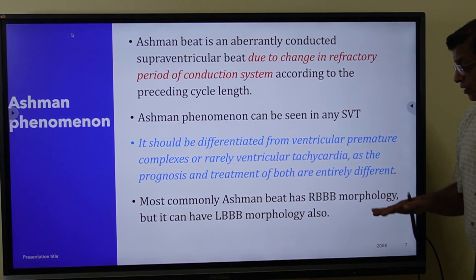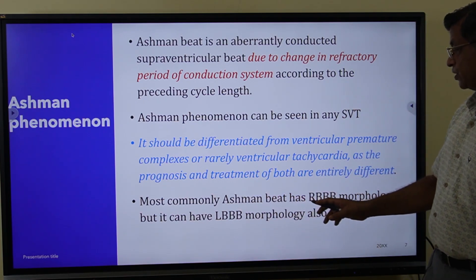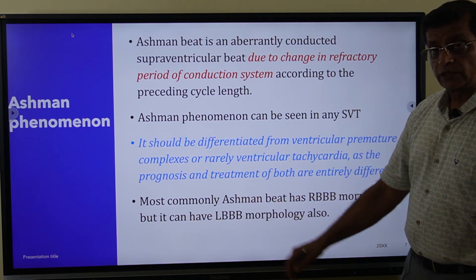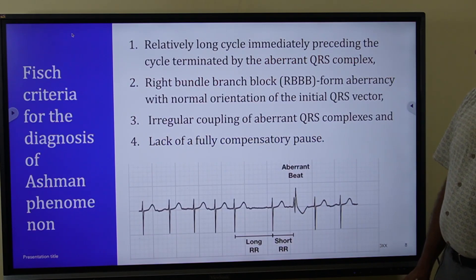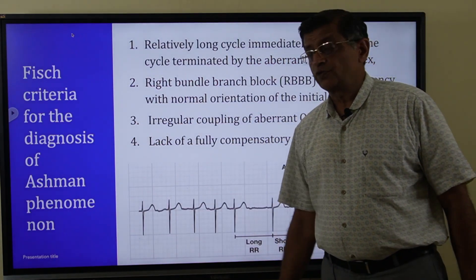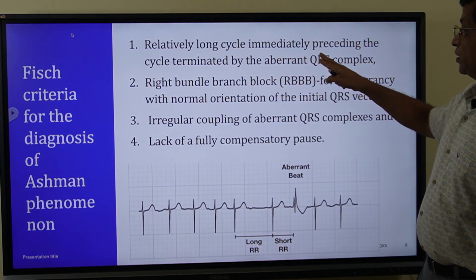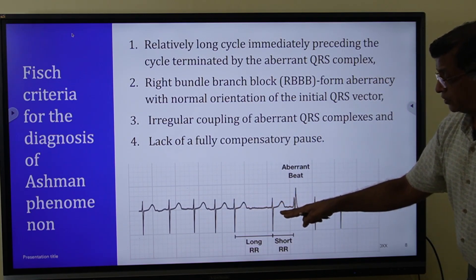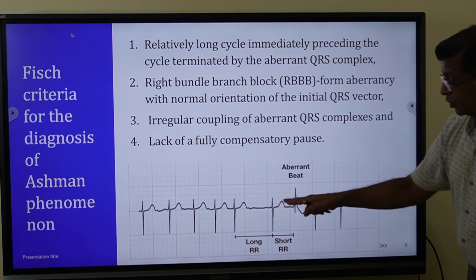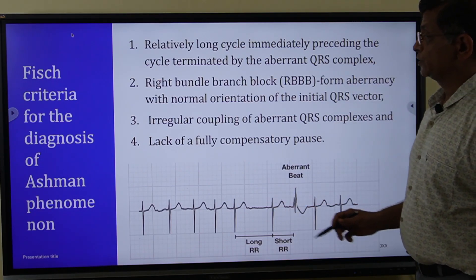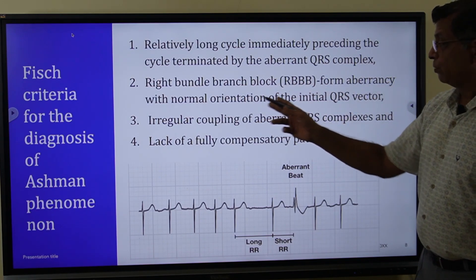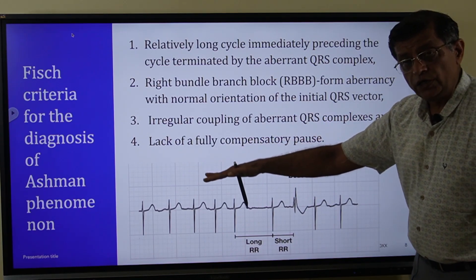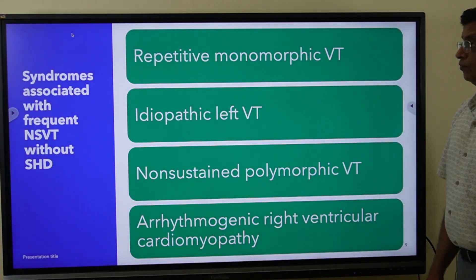Most Ashman beats have right bundle branch block morphology; sometimes they may have left bundle branch block morphology. The Fisch criteria for Ashman phenomenon are: a relatively long cycle immediately preceding the cycle terminated by the aberrant QRS complex, right bundle branch block form aberrancy with normal orientation of the initial QRS vector, irregular coupling of aberrant QRS complexes, and lack of a fully compensatory pause.